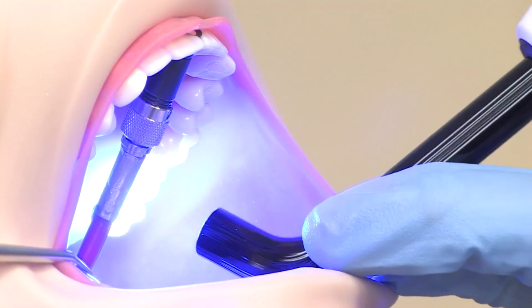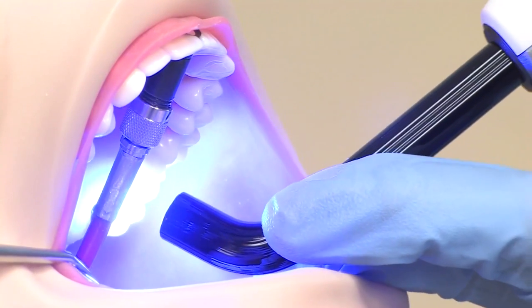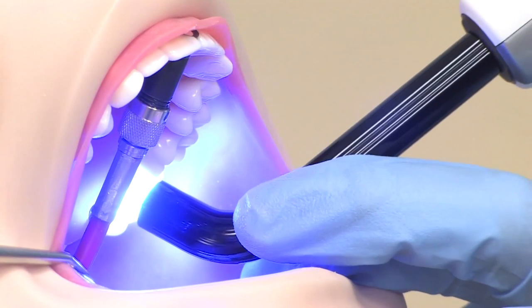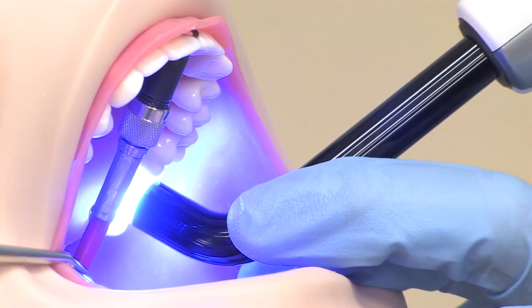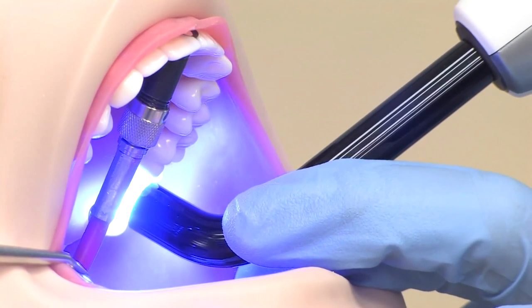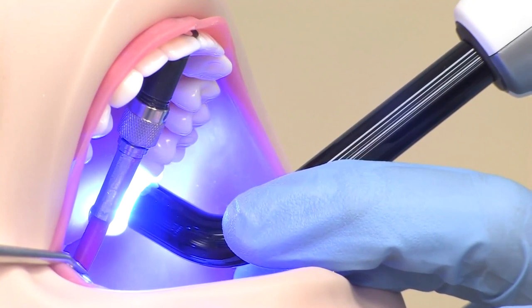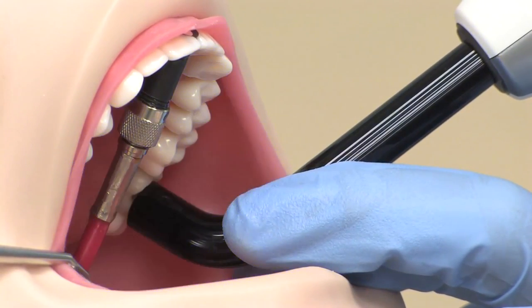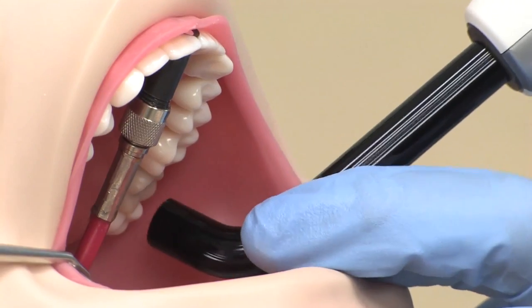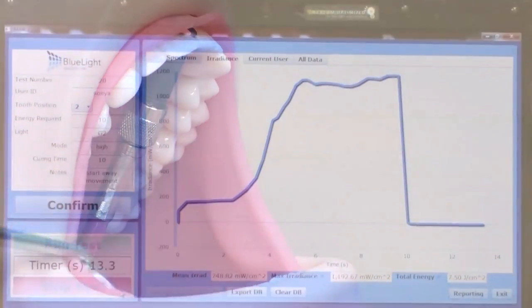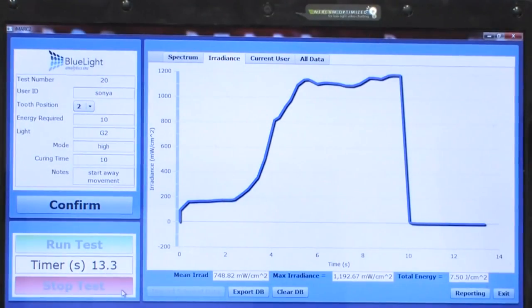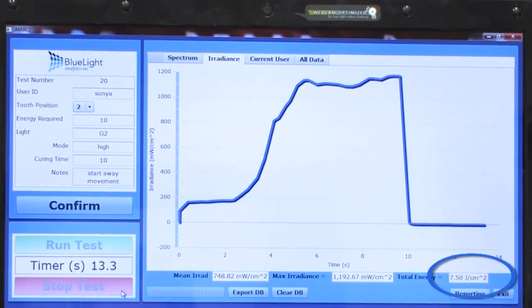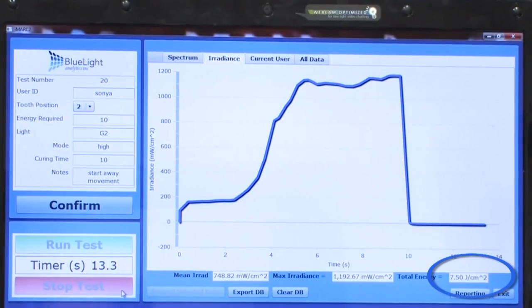Here we can see what happens when the light is far away from the restoration and is then brought in close. This technique delivered 7.5 joules per cm².